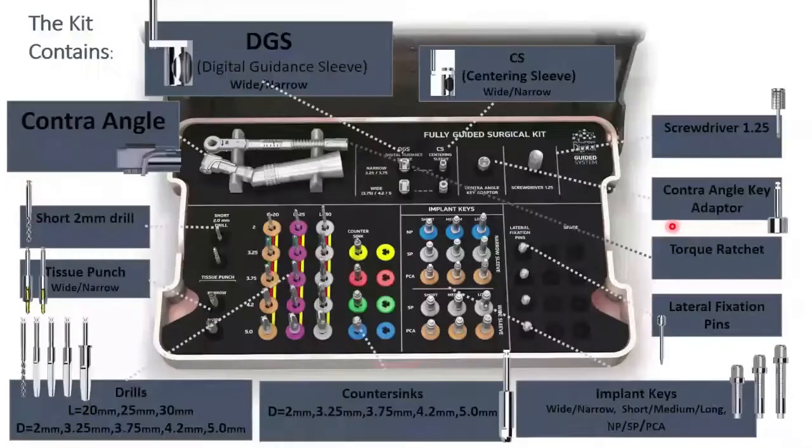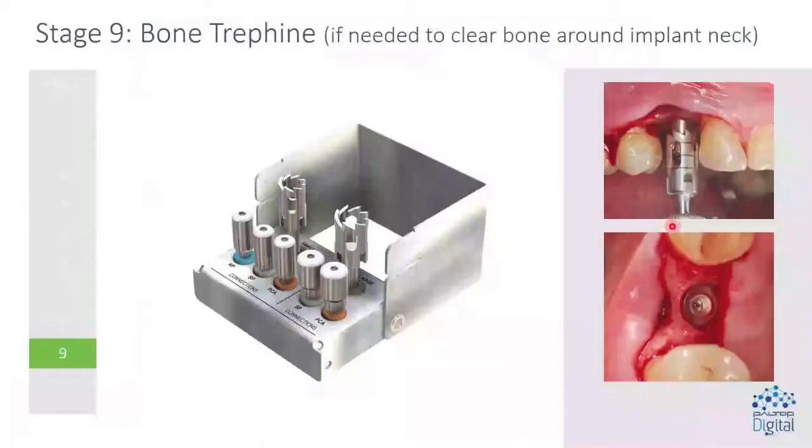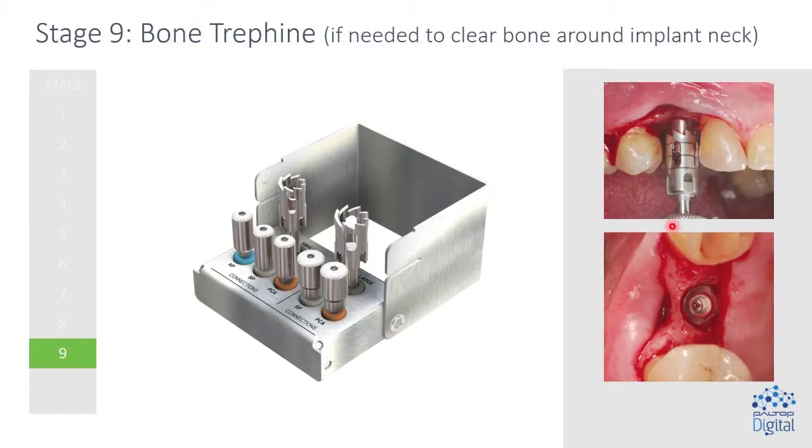This is what the kit looks like — everything you need is inside there. There's also a bone trephine. So if you're placing the implant subcrestal, that bone can interfere with seeing the components. This is a self-limiting system — you screw in what looks like a healing abutment and it guides the drill so it doesn't damage the implant and clears away any additional bone.